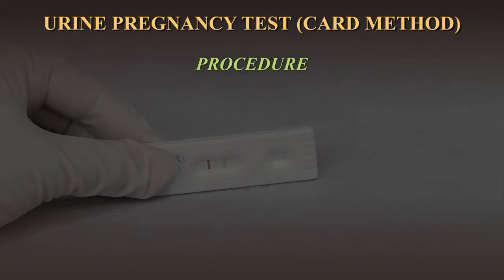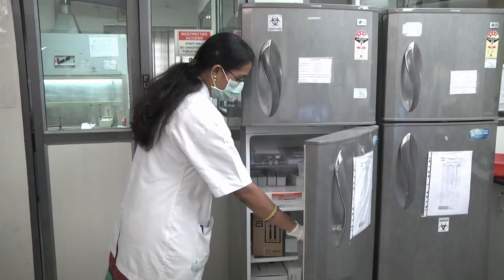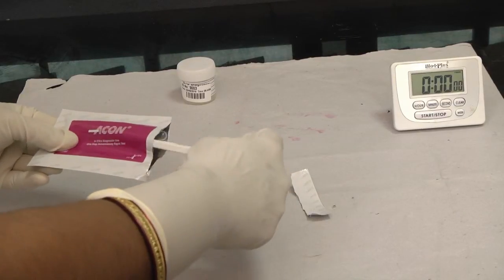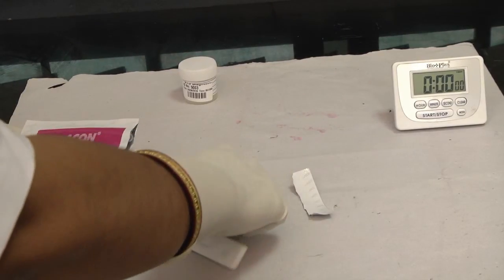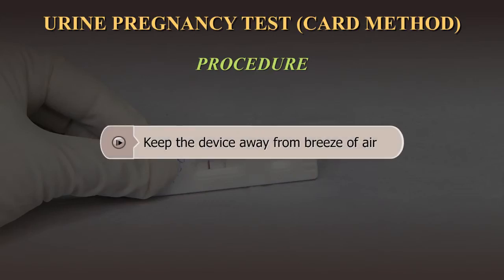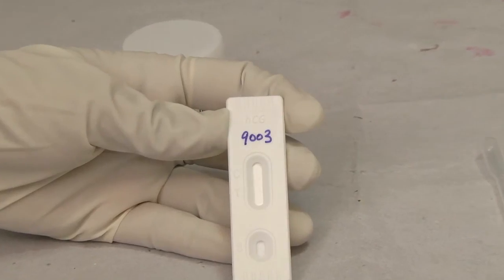Procedure: Follow standard precautions while performing the test. Remove the kit from the refrigerator and take out the test device from the pouch, bringing it to room temperature. Do not keep it open for a long period of time. The test device has a circular sample window and a result window marked C for the control region and T for the test region. Keep the test device on a flat surface, away from fan, dryer, or breeze of air, and label it with the patient ID.